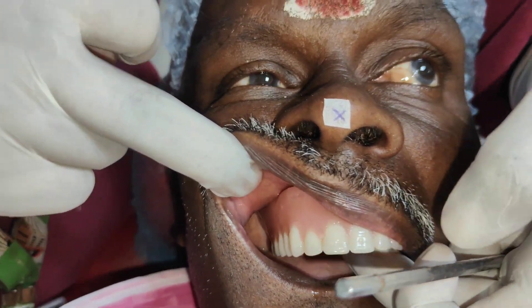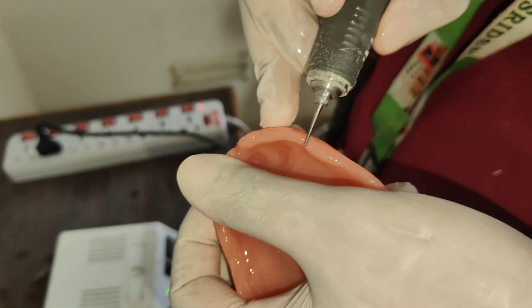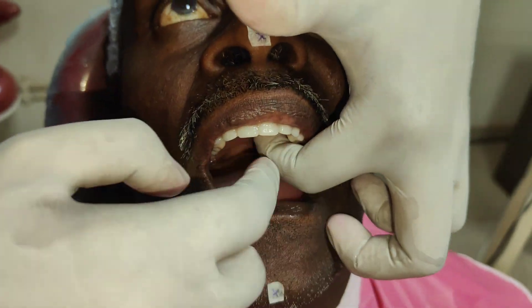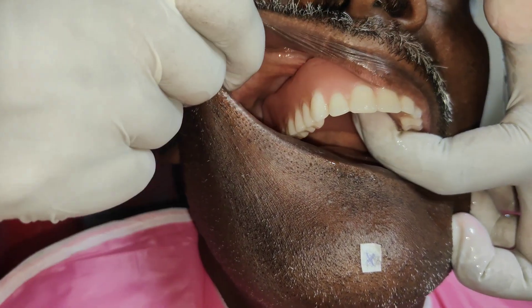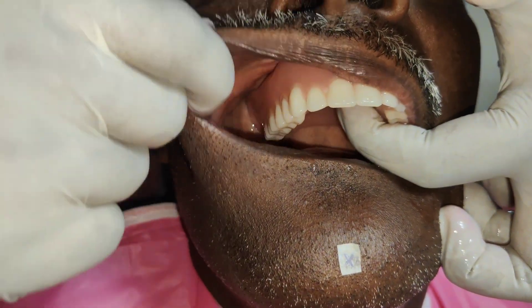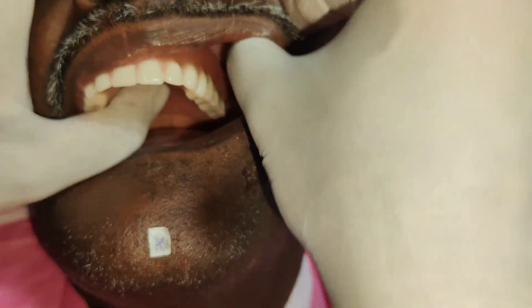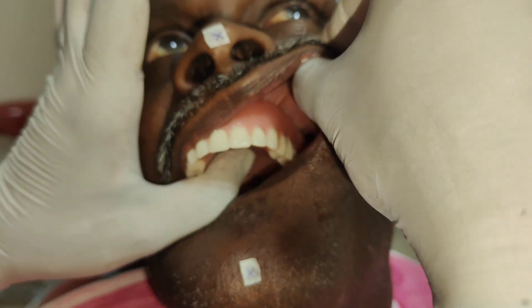If there is an excessive amount of frenal relief given in the labial frenum and the buccal frenum, or if it is inadequate — here the right buccal frenum relief is not given, which will lead to dislodgement of the denture — the frenal relief is corrected in this patient.